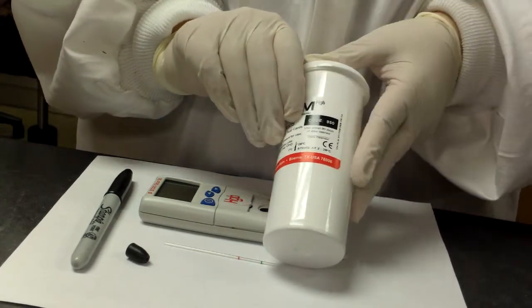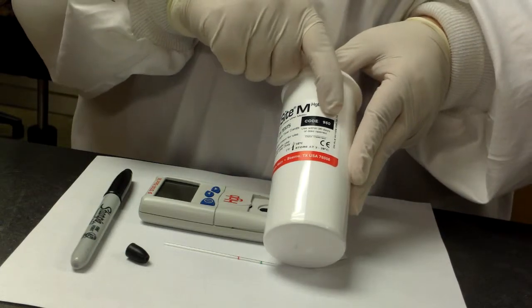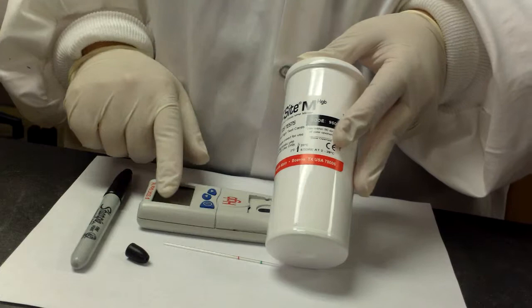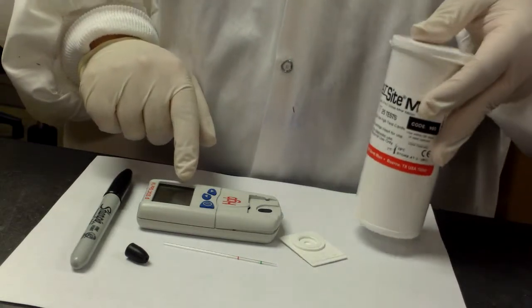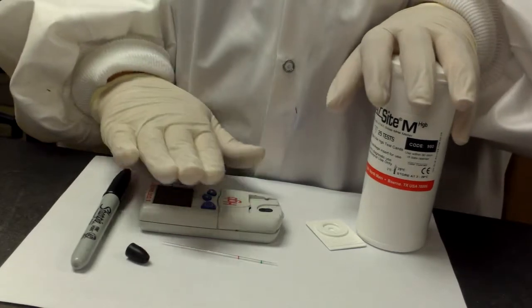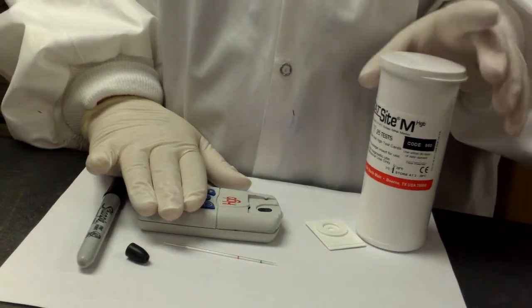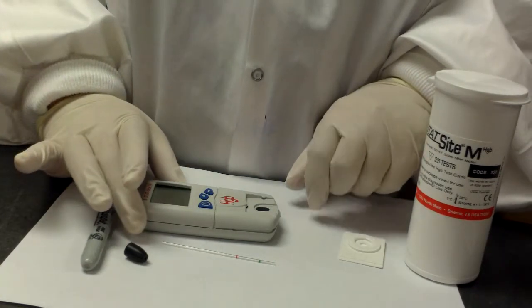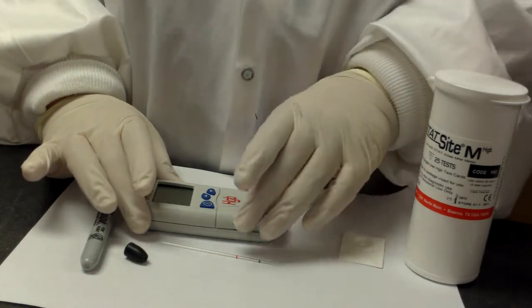On the outside of the can is a code. This particular case it's 950. When you turn the instrument on, it will read the new code here. You need to make sure that the cartridge you're using is the same code as the hemoglobinometer, because they are calibrated at the factory and your calibration will vary just a little, lot to lot.